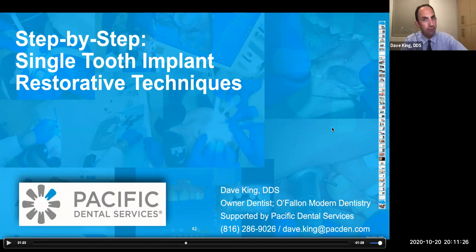I don't think so. How many thousands of cases of all-on-4s have been done that have worked really, really well with no issues? On the other hand, do we have any definitive data that supports doing 6 versus 4? I don't know. I've done a lot of the snap-on 2 implants down in the front, and they generally turn out really, really well.